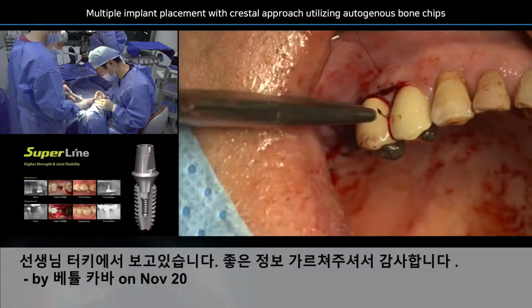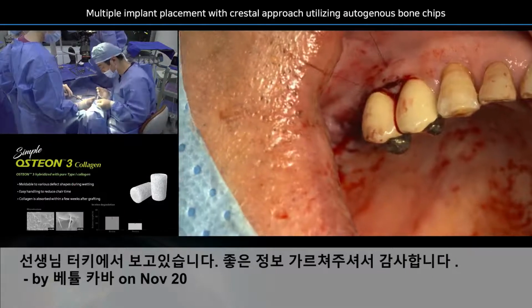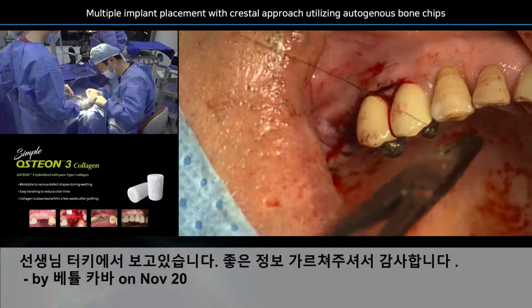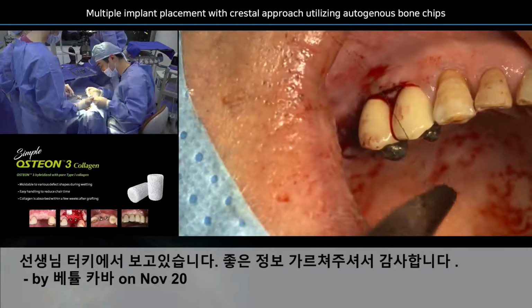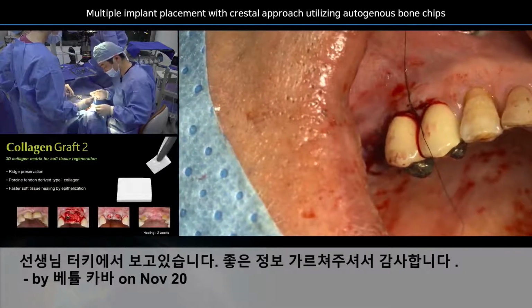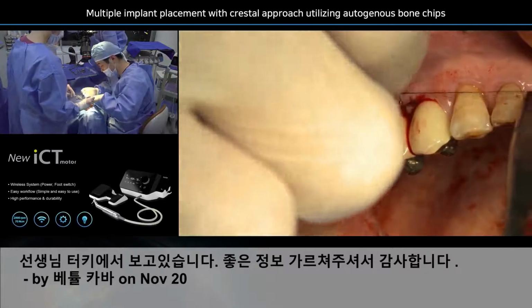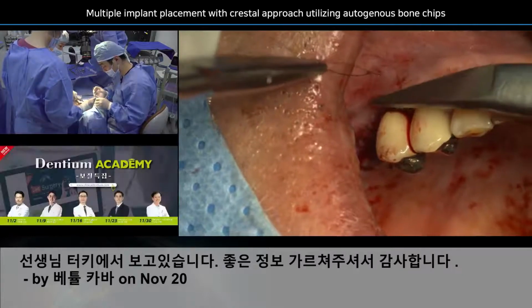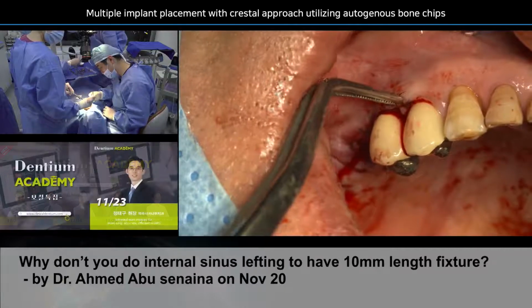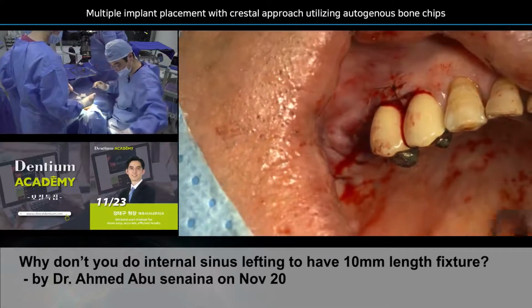So, do you see that very small, delicate movement? Because this 6-0 suture is so small and fragile, you cannot really apply much tension like you used to do. So be very careful. Move in very small, limited spaces. And do you see that it's already nicely matched because this flap has been placed surface to surface. The healing will be quite nice also.